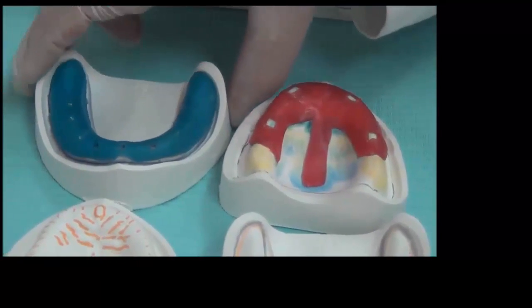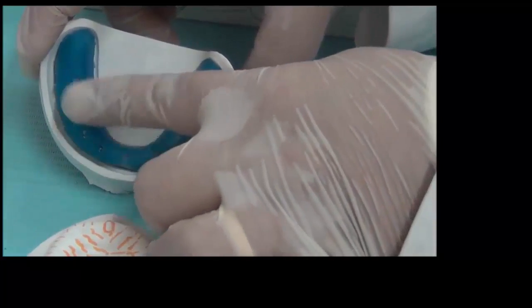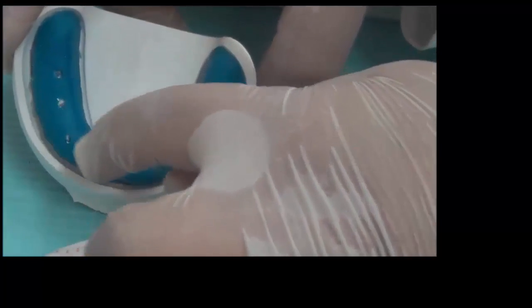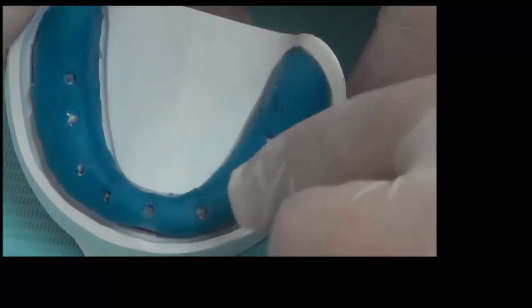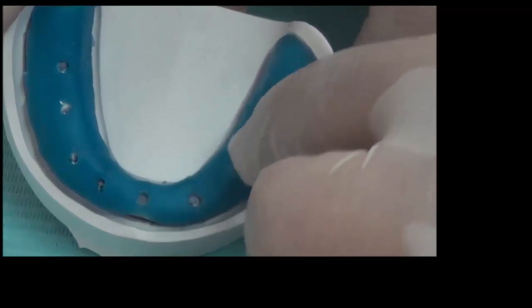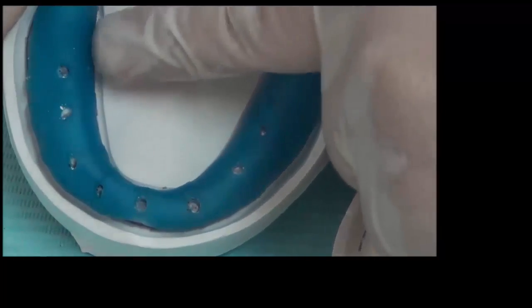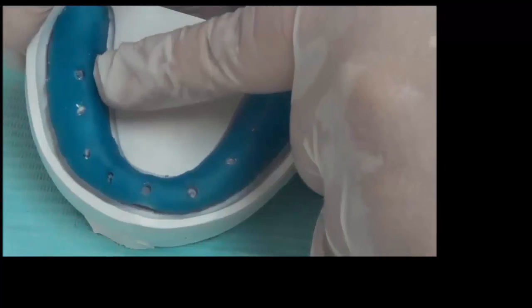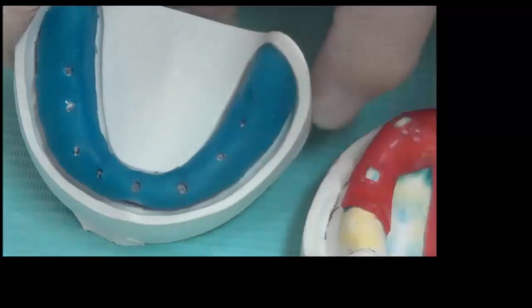Or we can fabricate a tray that has no spacer in it. But in the areas we need relief, just before adding the handle, we put in holes. Once under impression, the impression material can escape from these holes and the pressure beneath will be reduced. While on the slope area where no holes are present, the impression material is compressed between the tray and the tissue, and we will have a tissue compressive status. So tissue static here, tissue compressive here.